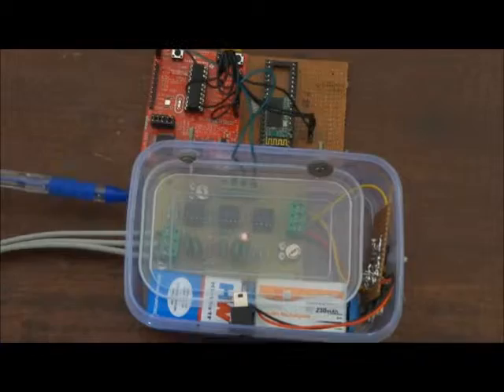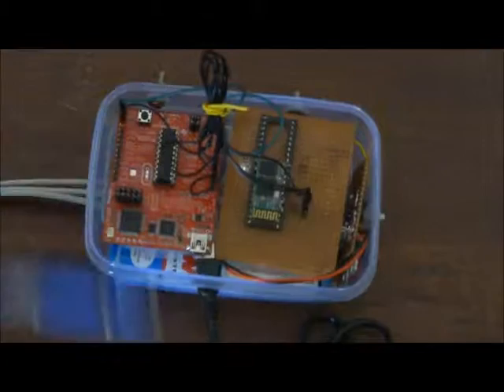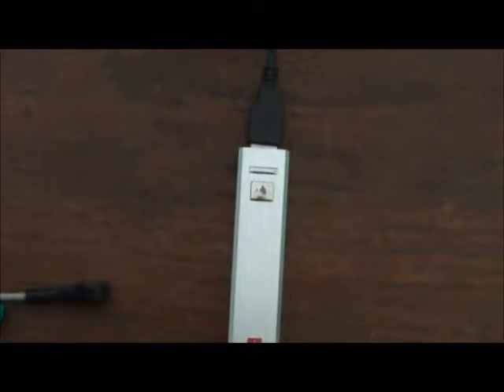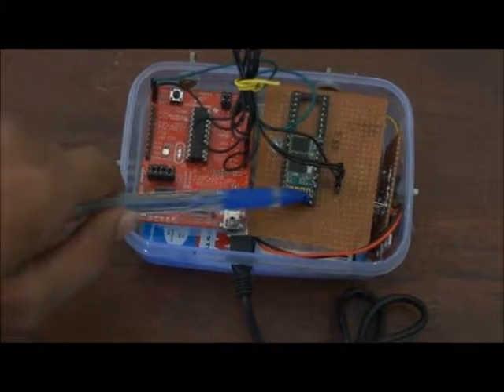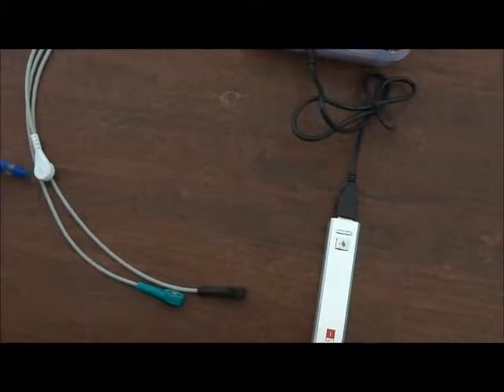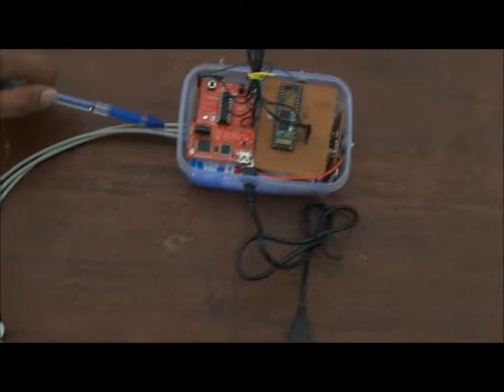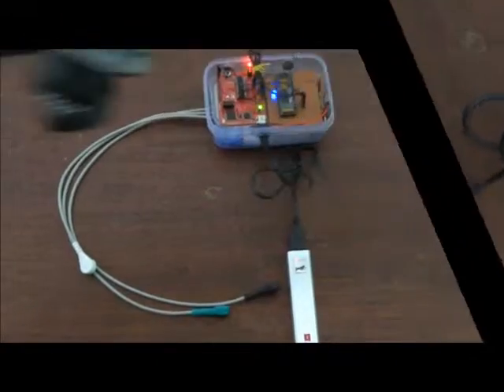Now we shall move on to the packaging of the system. We have thought of two layers inside the box. The bottom layer consisting of the ECG amplifier part and the top layer consisting of the digital transmitter section. This is the battery pack which is used to power the MSP430 microcontroller. As you can see, the components fit inside the box perfectly. These ECG cables have been cut short to be attached to the body of the person while he is moving. This box is what the person shall carry while he is in motion.